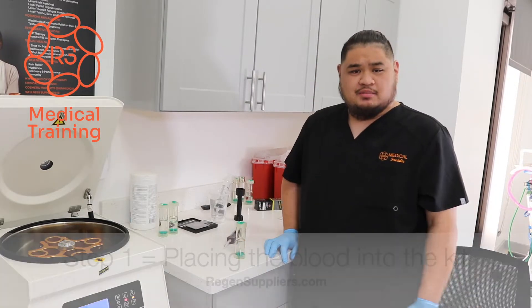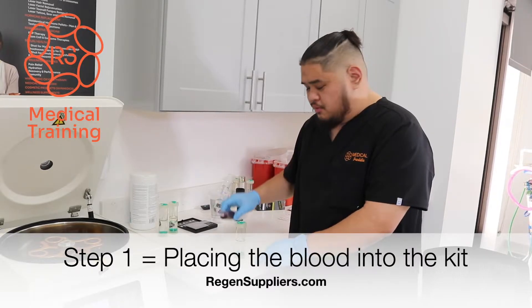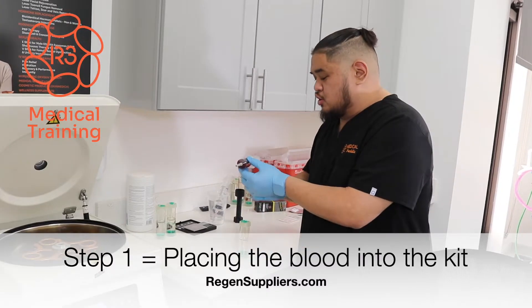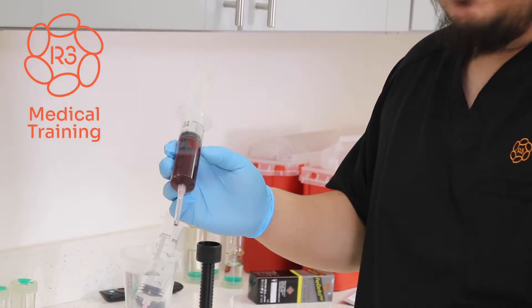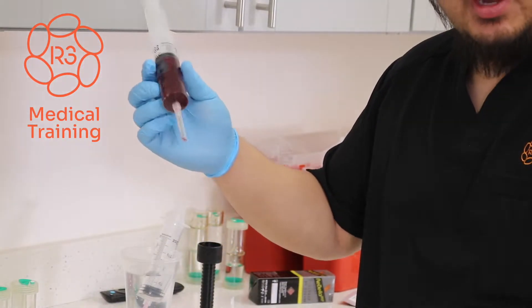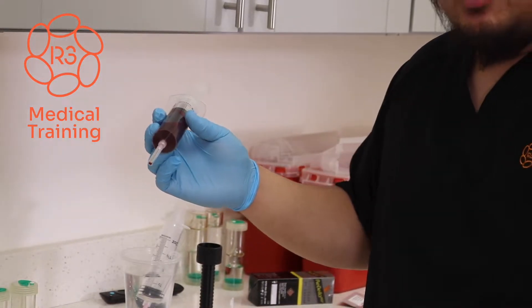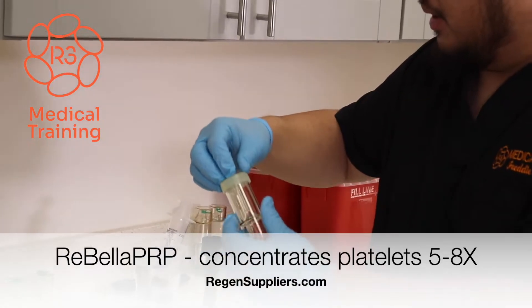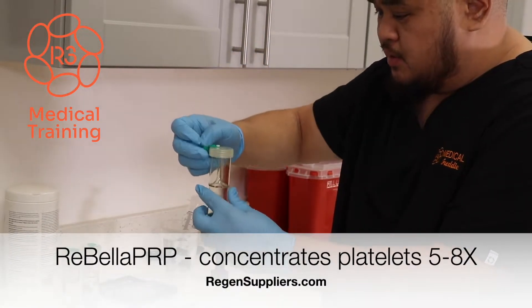We've just completed a patient blood draw. The next step in the process is to add the blood sample into the PRP tube. Now in the syringe we have 27 cc's of whole blood with 3 cc's of anticoagulant, just to prevent the blood from coagulating while you're in the process of doing PRP. So the first step in inserting the blood into the tube is to pop off this rubber gasket on top of the 30 cc kit.